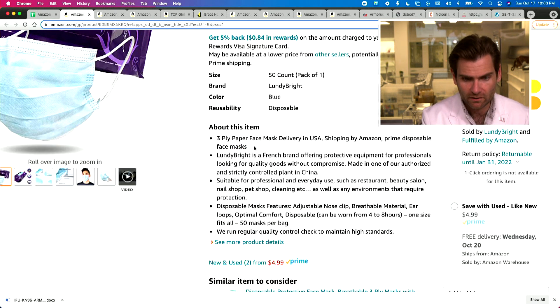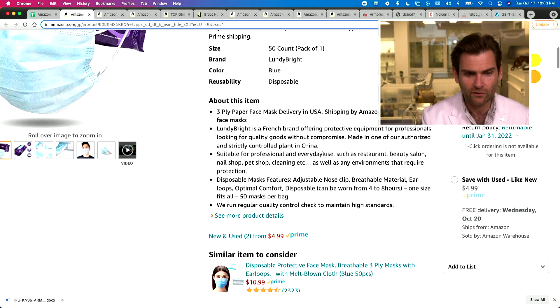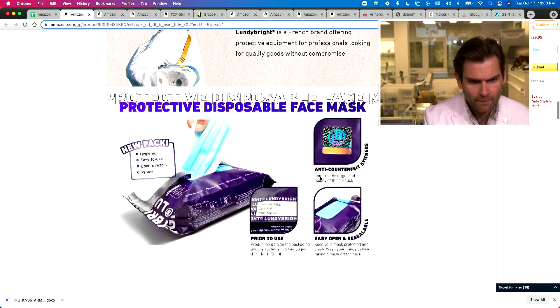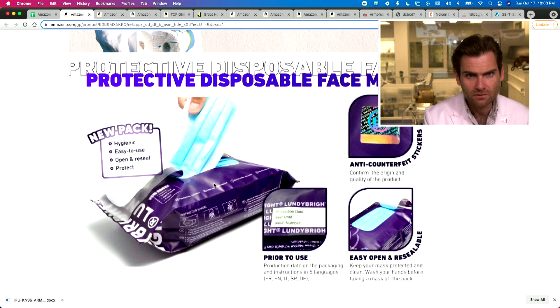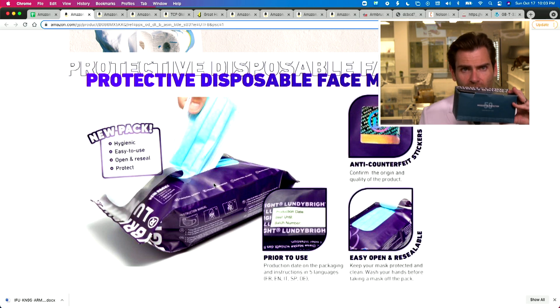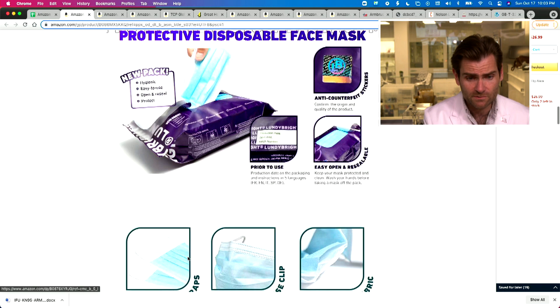Lundebright is a French brand offering protective equipment for professionals, made in one of their authorized and strictly controlled plants in China. What's weird is it's got this diaper wipe situation going on here, and that's not the box that showed up — it's just a regular box, but I do like the box. They spent some time on it.